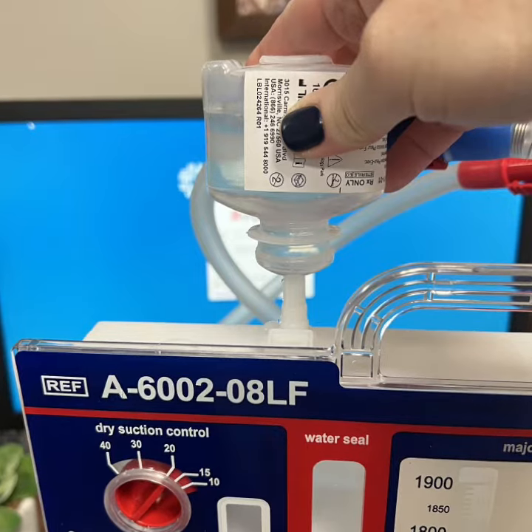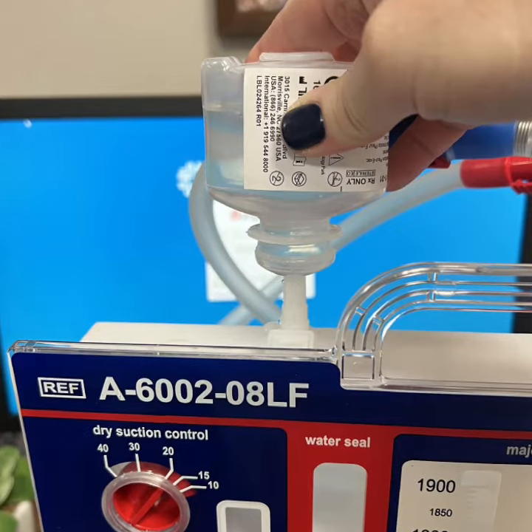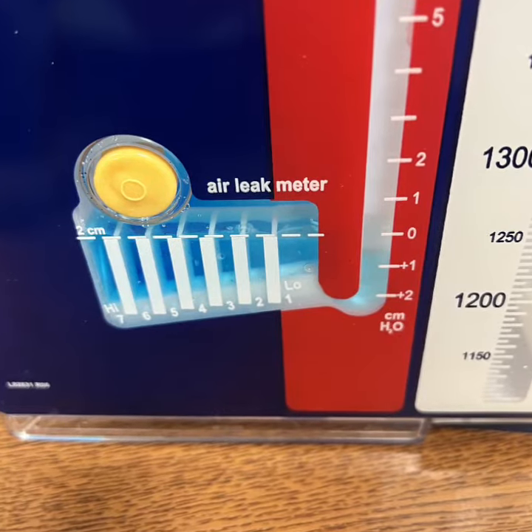Then you will use this port to connect the suction tubing to the regulator on the wall, not through a canister. The water in the water seal will turn blue and should reach the two centimeter dotted line.